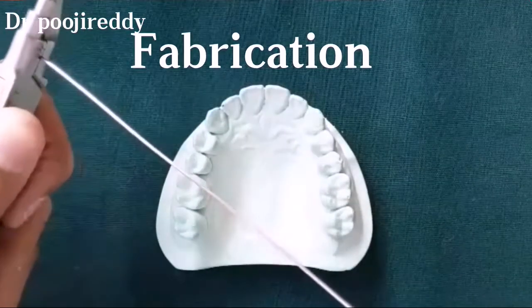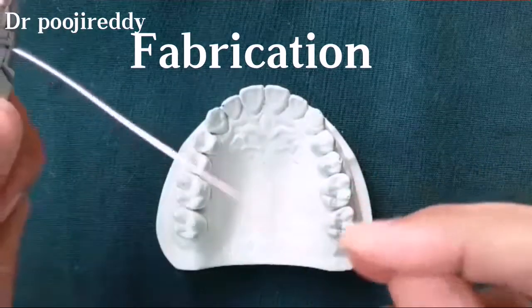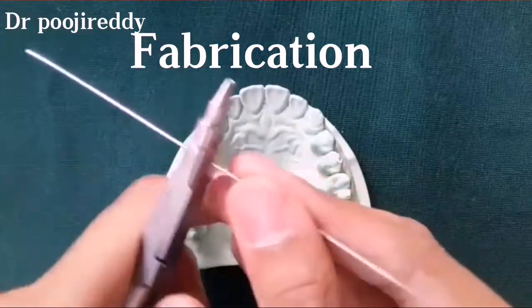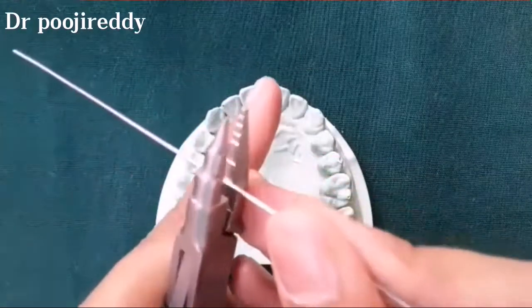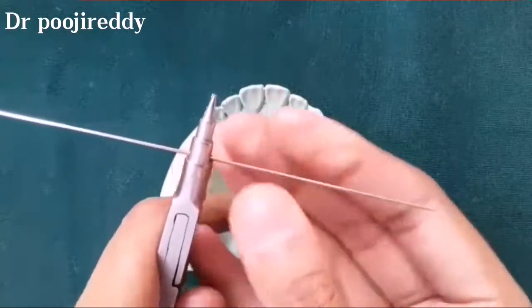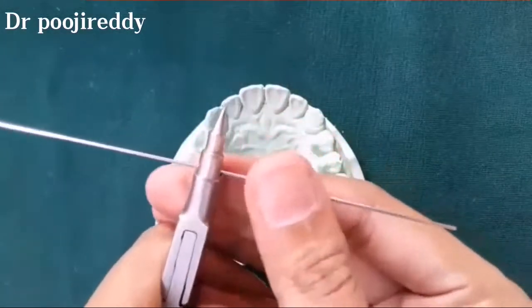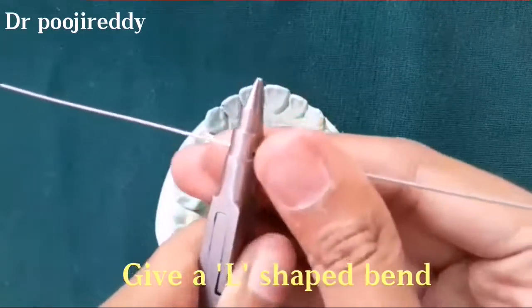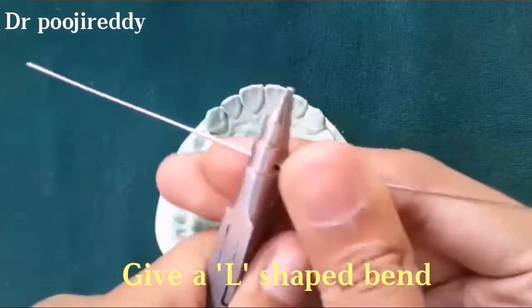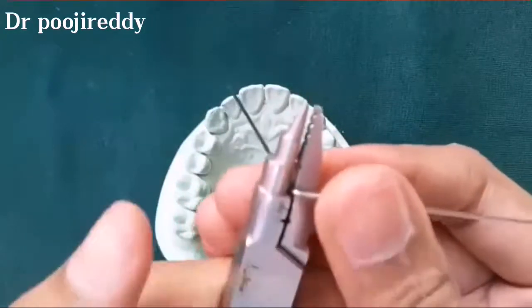Now coming to the first step of fabrication of an Adams clasp: that is straightening of wire. Usually 21 gauge stainless steel orthodontic wire is used for the fabrication of Adams clasp. After completion of straightening the wire, give an L-shaped bend as you are seeing right now.